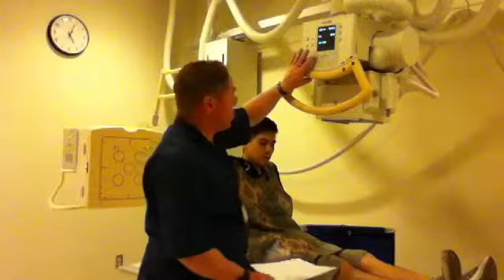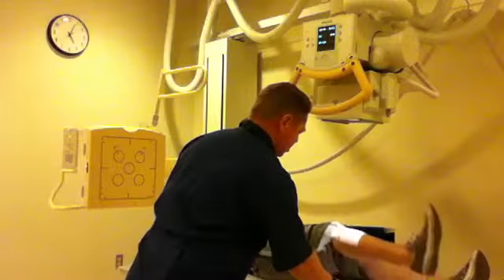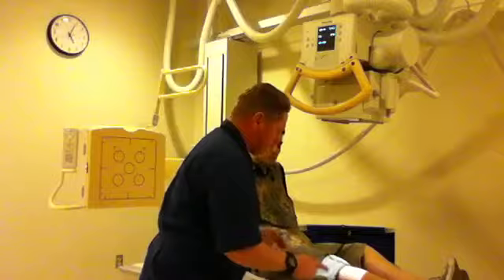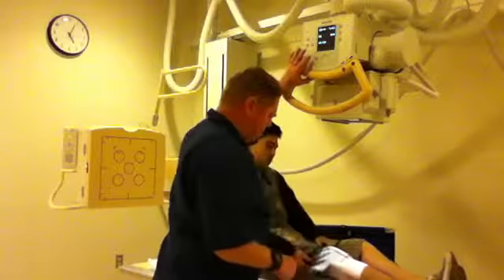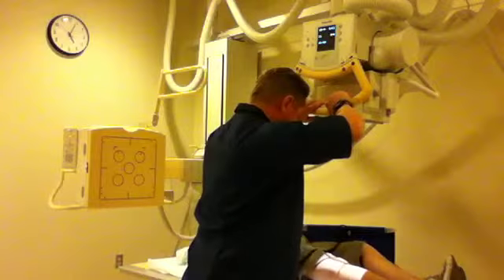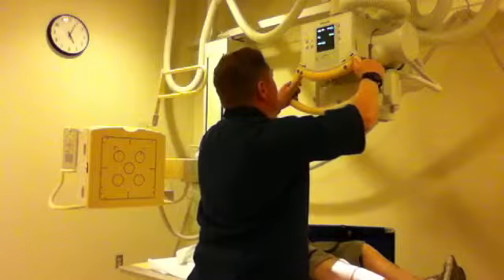Now I'm going to go into the AP oblique knee. Lift up. And make sure that the whole leg is turned oblique internally. Again, it's going to be half inch. I'm going to go ahead and straighten my tube up.